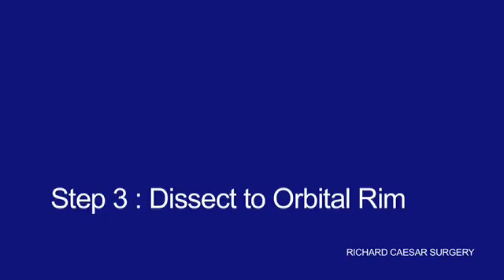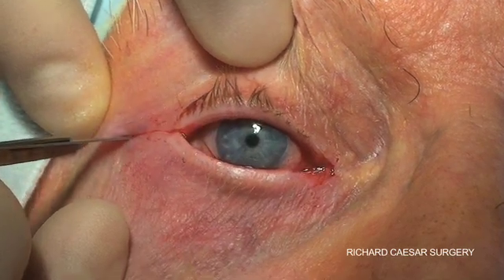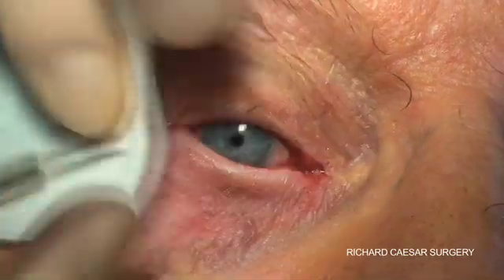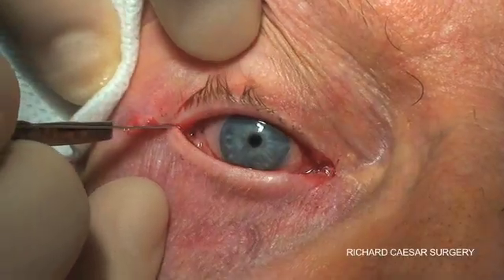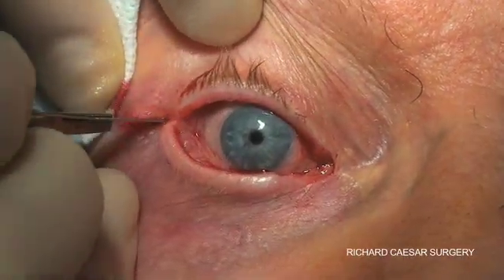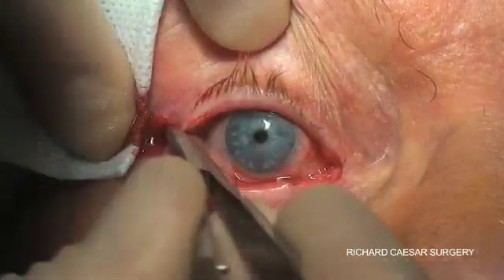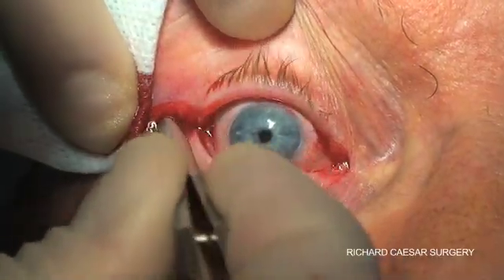The initial dissection is very straightforward. You follow the line and with a few strokes you should be straight through the skin, through the fibres of the orbicularis and down to the orbital rim. There's no anatomy here that you need to worry about — this is all soft tissue.